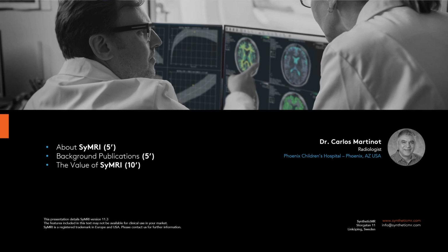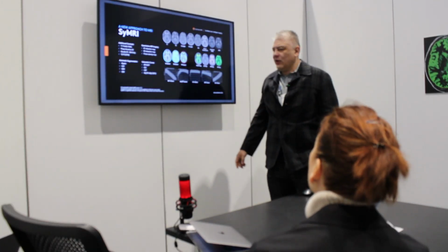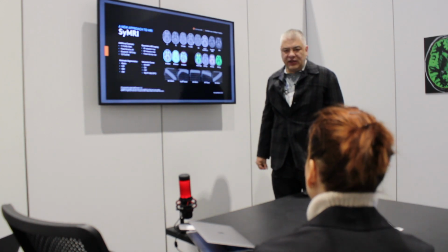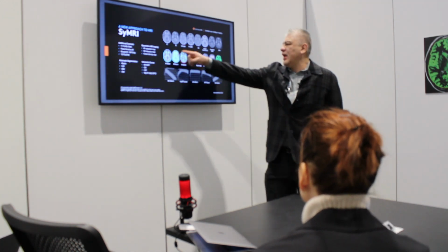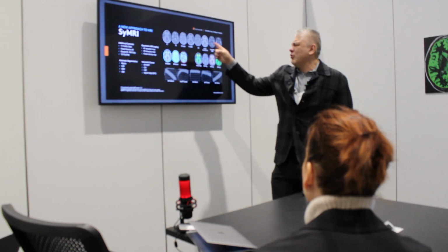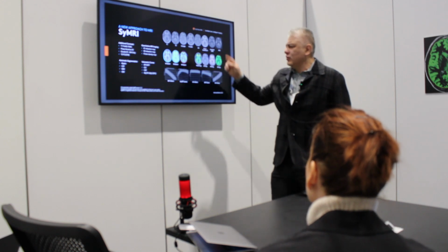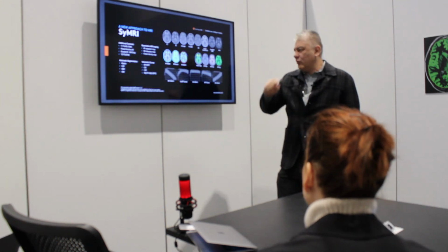It generates in one acquisition all these different contrasts. For now, just on the axial plane, but the 3D is coming, of all the echoes: T1, T2, FLAIR, T1 FLAIR. This is just a sample. It's about 12 contrasts, right, John? Right. It's about 12 different contrasts that get generated in one acquisition.